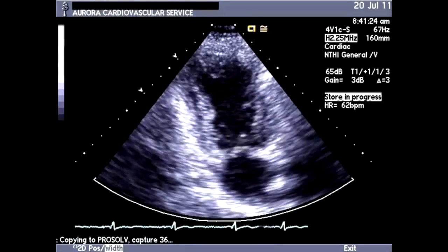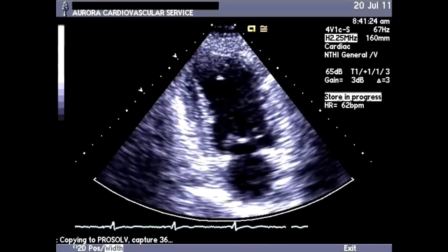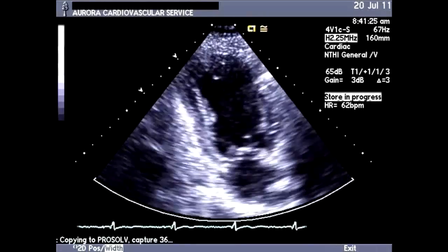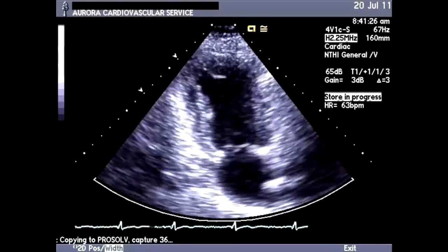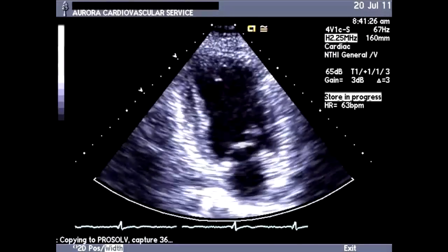And again, the 2-chamber view. And here again, the sonographer, there was no resting image because they chose, once they got to that apical window, that they were surely going to use contrast. So that's case number 3. So answer the questions. Was it indicated to use contrast, or did the echo images without contrast answer your questions?